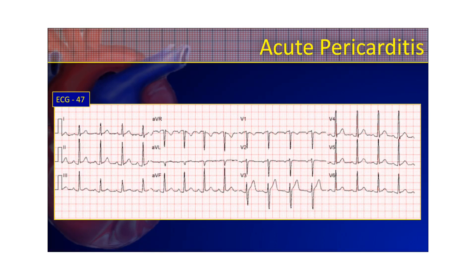Here's another good example. You do see that Spodick's sign — the downward trending of the baseline of the isoelectric line — from the J-point all the way down into the PR segment. You have concave ST elevation, albeit not that impressive on this 12-lead. But you might even note a little bit of PR segment depression there, certainly in lead two, indicating a more viral pericarditis. And that ST elevation, albeit not that significant, is more indicative of an acute pericarditis.